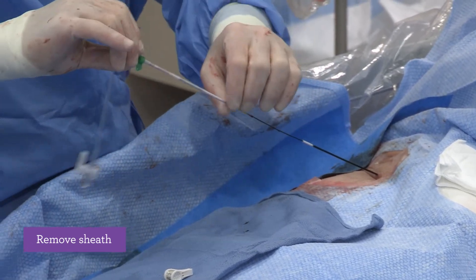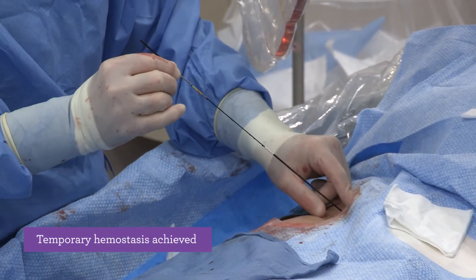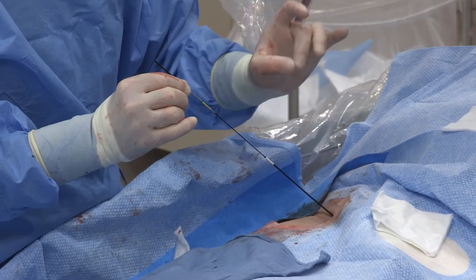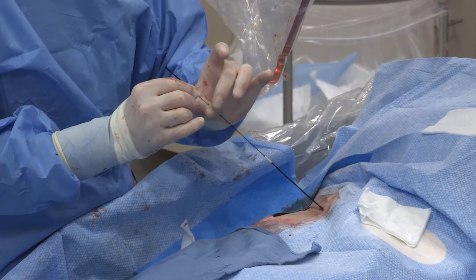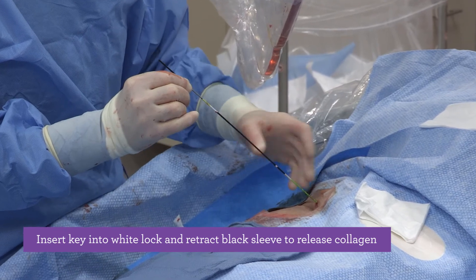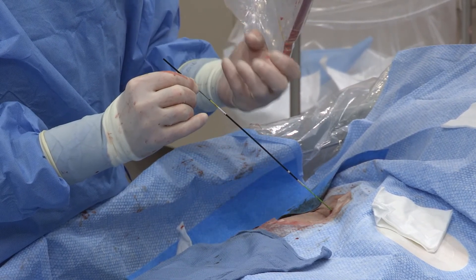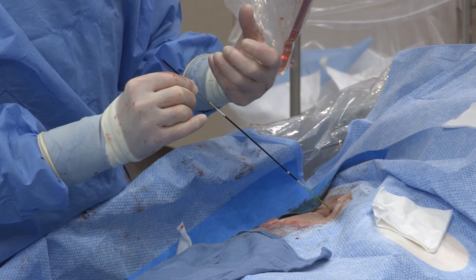I remove the sheath, hold in place, and this is called the sweet spot — the spot where the device is not bleeding. The disk has a membrane on it that prevents bleeding, indicating it is sitting literally at the arteriotomy site. Once I am sure of that, I bring my key down, bring my black tube back, and the collagen is open. I wait 15 seconds — according to the IFU, 15 to 30 seconds. The collagen will absorb water and some blood, become activated, and sit on top of the artery.